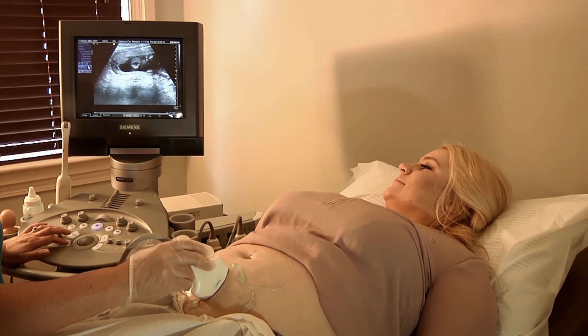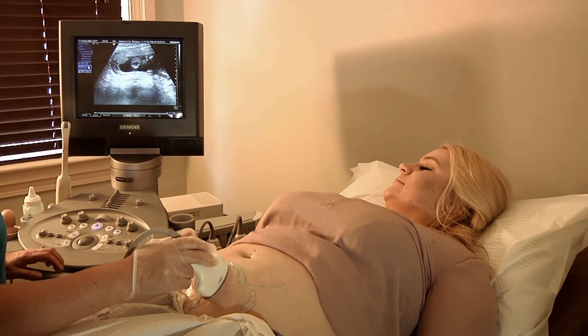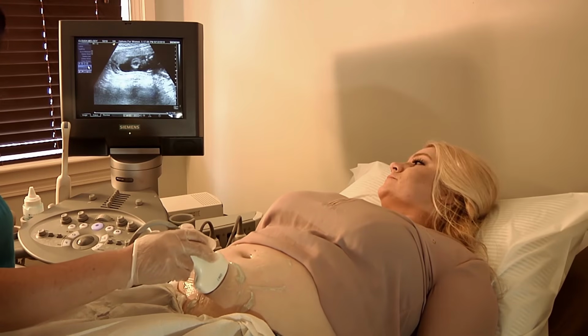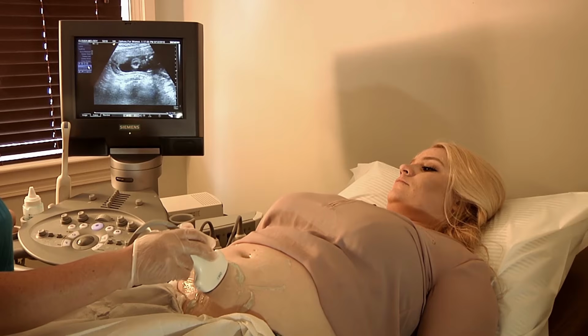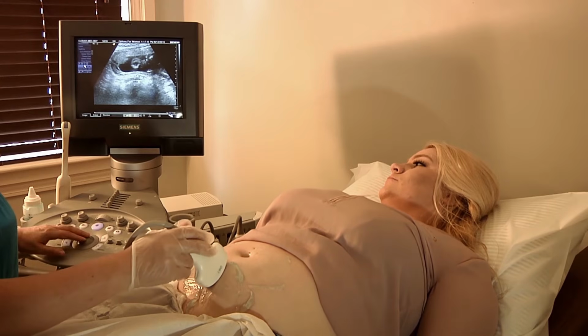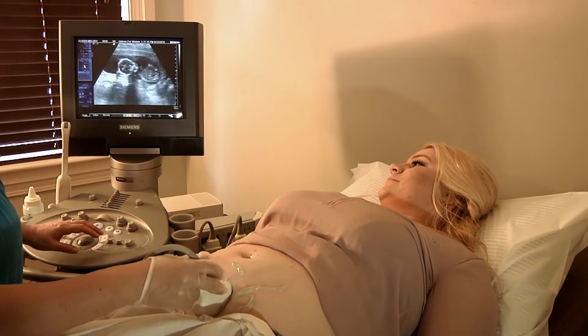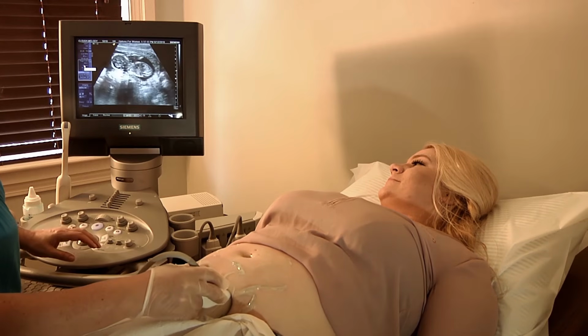Sherry, how much do you want to have to the left of the fundus, or does it matter? To the left of the fundus? Yeah, on the screen, does it matter? All you want to do is get the top of the fundus. It won't do it. All right. We haven't figured out the text. We'll figure it out. Okay.